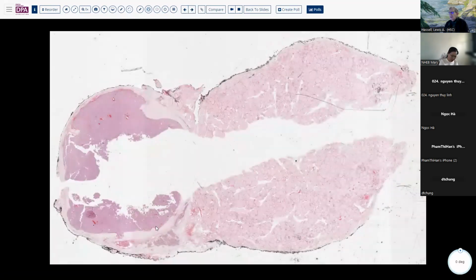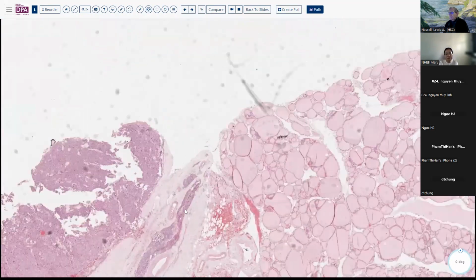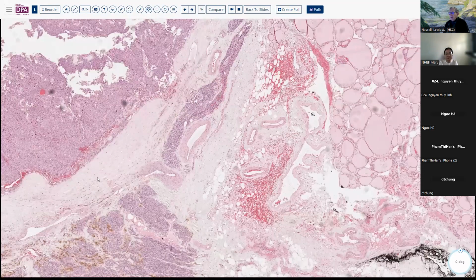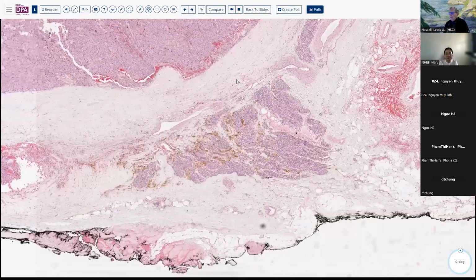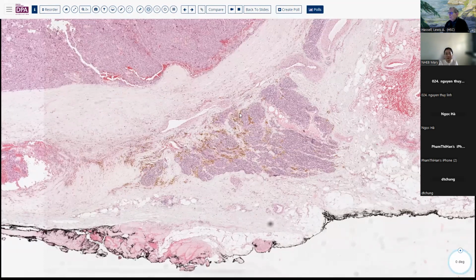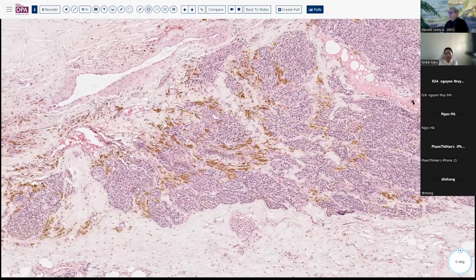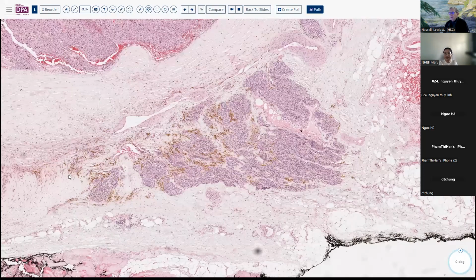Here's an example of a tumor that was very closely adherent here and on additional sections was actually invasive into the thyroid. Again, this is a case where we had some possibly peripheral parathyroid tissue that had shown some evidence of old hemorrhage. But notice again that this does not have any residual parenchymal fat.